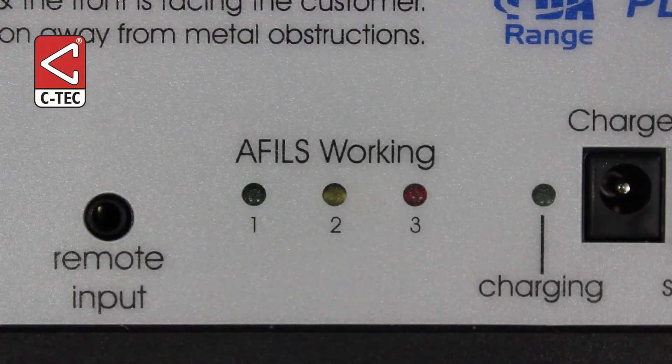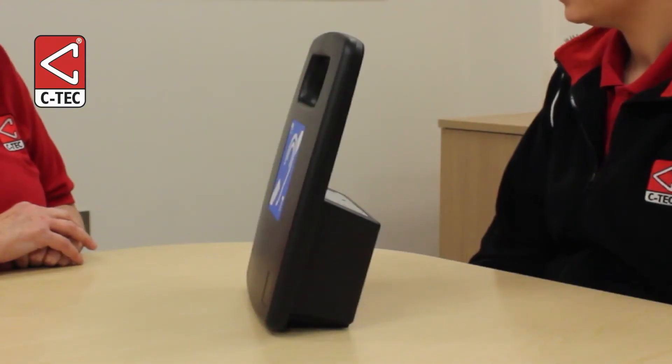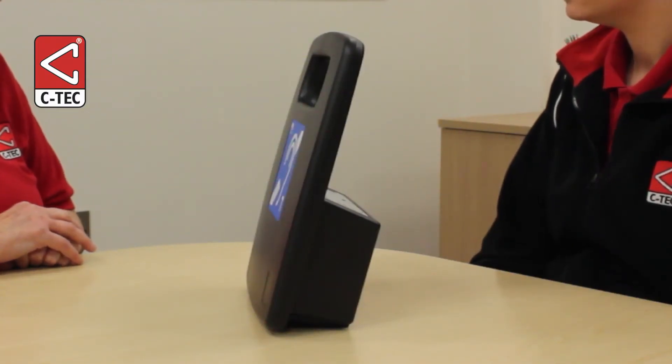Talk to the hearing aid user as normal. You do not need to talk directly into the internal microphone as it has a wide pick-up range. Check the amplifier's AFIL working indicators to ensure they illuminate in line with your speech. 1 and 2 is normal; 2 and 3 is too loud.